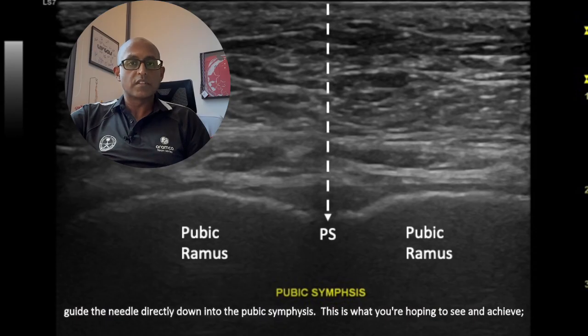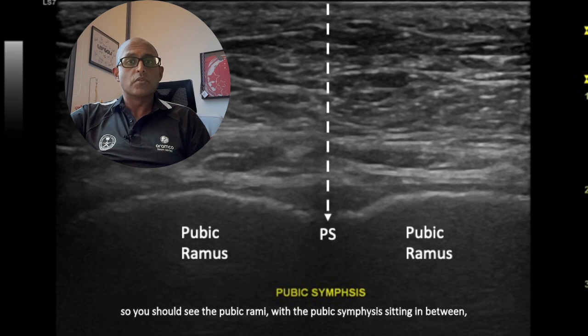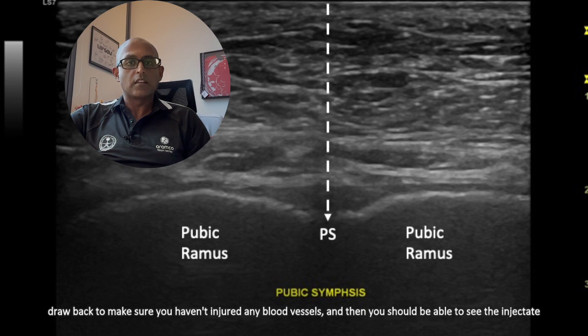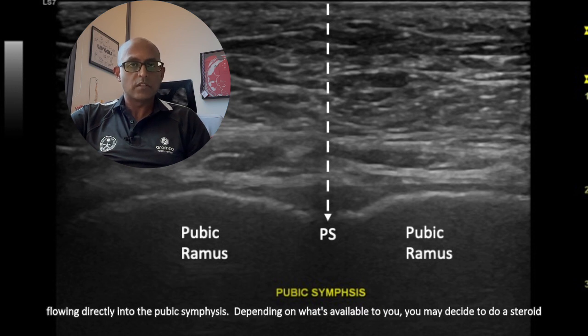This is what you're hoping to see and achieve: you should see the pubic rami with the pubic symphysis sitting in between, and you want to see the needle guided directly down into the pubic symphysis. When you are in this area, you can draw back to make sure you haven't injured any blood vessels, and then you should be able to see the injectate flowing directly into the pubic symphysis.